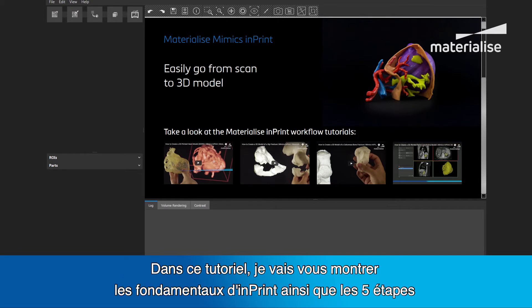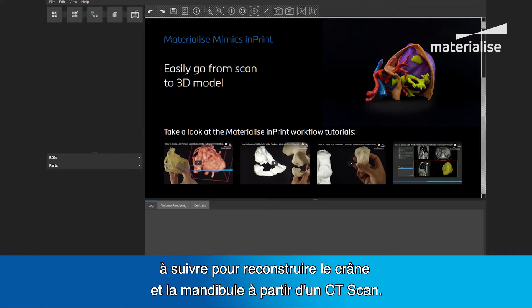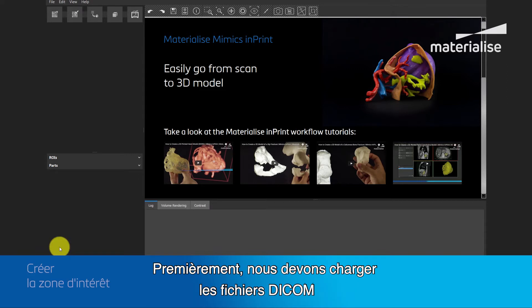In this clip, I will show you the basic layout of Imprint and the 5 steps you will have to follow in order to construct the cranium and the mandible from a CT scan. First, we need to load in the DICOM files.